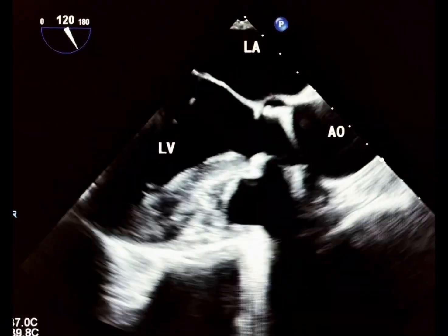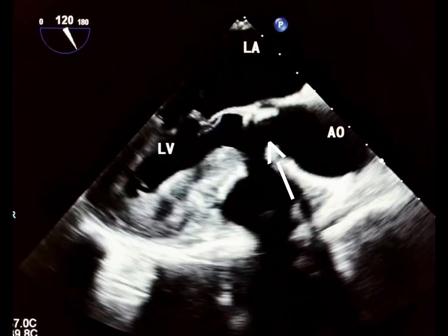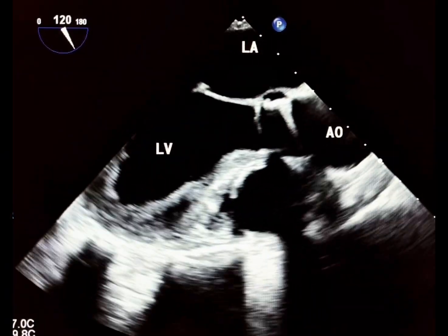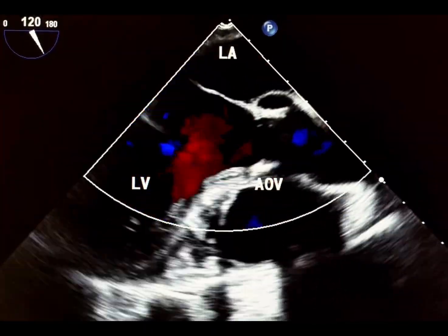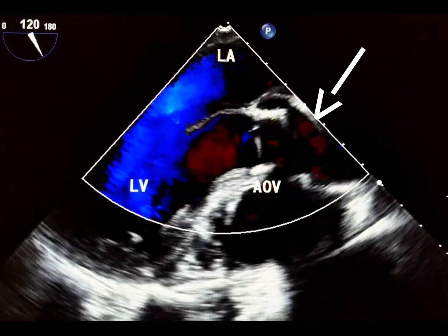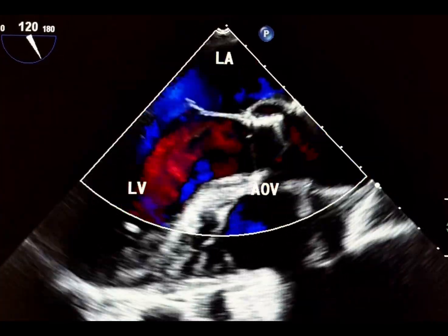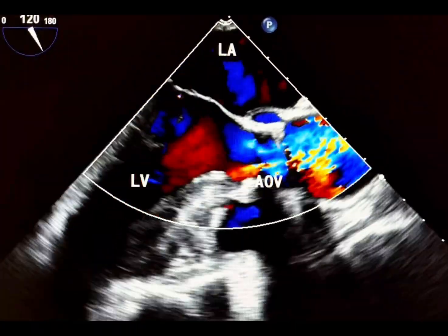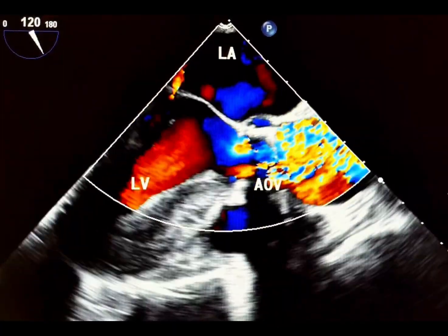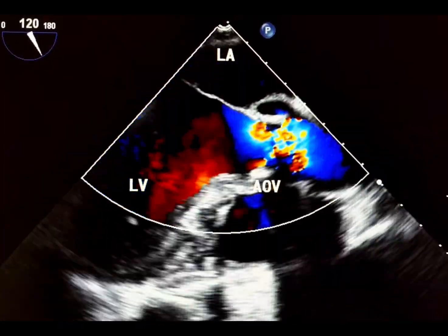This transesophageal echocardiographic examination demonstrates normal leaflet motion, normal leaflet thickness, and no evidence of thrombus or structural degeneration. Always remember that increased transprosthetic flow can substantially increase Doppler gradients. Patients with anemia, sepsis, hyperthyroidism, AV fistula, and pregnancy may develop very high gradients despite a normal prosthesis. So always ask, is the flow unusually high?